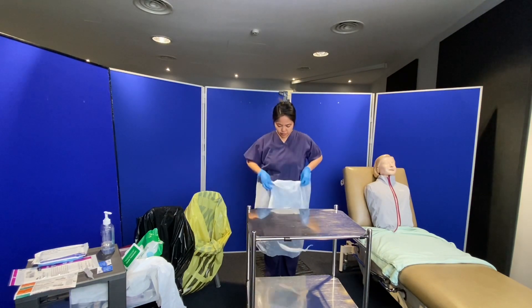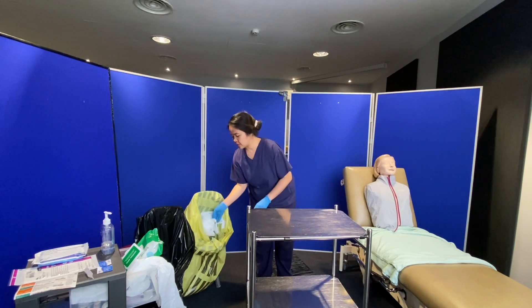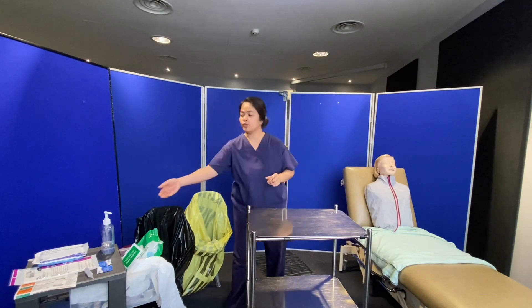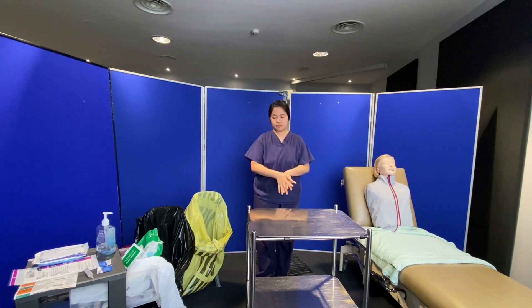I will be removing my PPE, discarding it in the clinical waste bin, and doing my hand hygiene before preparing my equipment for wound dressing.